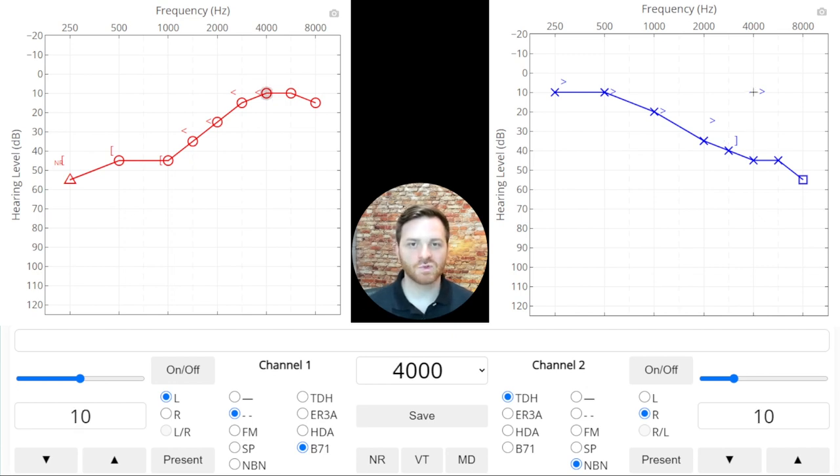Last one, we're in the home stretch. So we'll set the masker at the air conduction threshold of the non-test ear. I feel like I sound like a broken record, but hopefully it helps to hear it said over and over and over again. Air conduction threshold of the non-test ear, we're gonna add a 10 dB safety pad. No occlusion effect because we're measuring in the high frequencies. So we're gonna start our masking, and I'm gonna go up in 10 dB steps to save some time. Again, this would totally work in 5 dB steps if you're not sure.